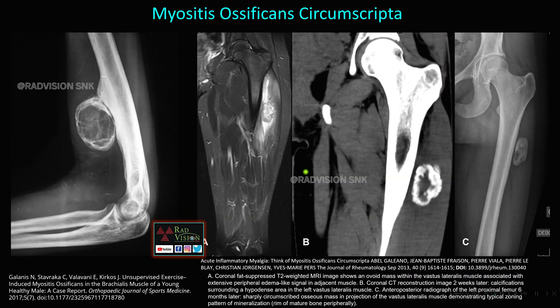Here you can see a lucent lesion with a peripheral eccentric rim of calcification and central lucency, separated by a cleft from the bone — this is typical myositis ossificans circumscripta. Here also you can see a lesion in the vastus lateralis with adjacent edema; after two weeks a peripheral eccentric rim of calcification with central lucency appears, and after six weeks there is a zone of mineralization with mature bone formation. Typical location, peripheral calcification, central lucency, separation from bone by a cleft, and prior trauma history should suggest myositis ossificans rather than tumor.